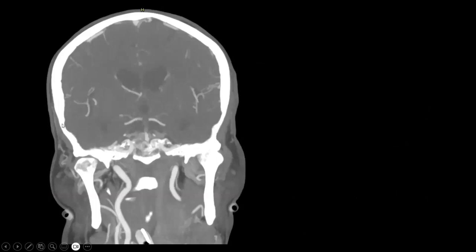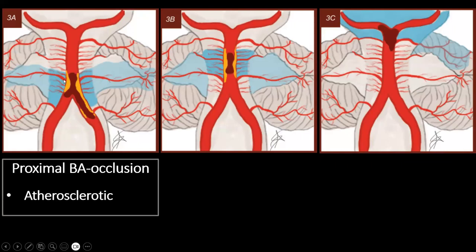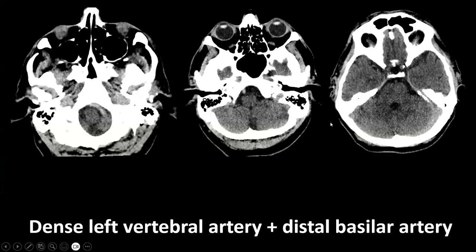Now, let's talk a bit about CT angiography. The role of CT angiography is primarily to detect the site of a large vessel occlusion. And let's magnify the CT angiography studies in this patient over here. We see that there is a complete occlusion of the distal part of the basilar artery. And it's very difficult to miss an occlusion this size. The basilar artery can be occluded in its entirety, or occluded more focally. Generally, when you have occlusions of the proximal part of the basilar artery, these tend to be atherosclerotic occlusions. The same applies to occlusions of the middle part of the basilar artery, while distal basilar artery occlusions tend to have a cardioembolic origin, and cardioembolic origin will be more frequent in an occlusion located over here.